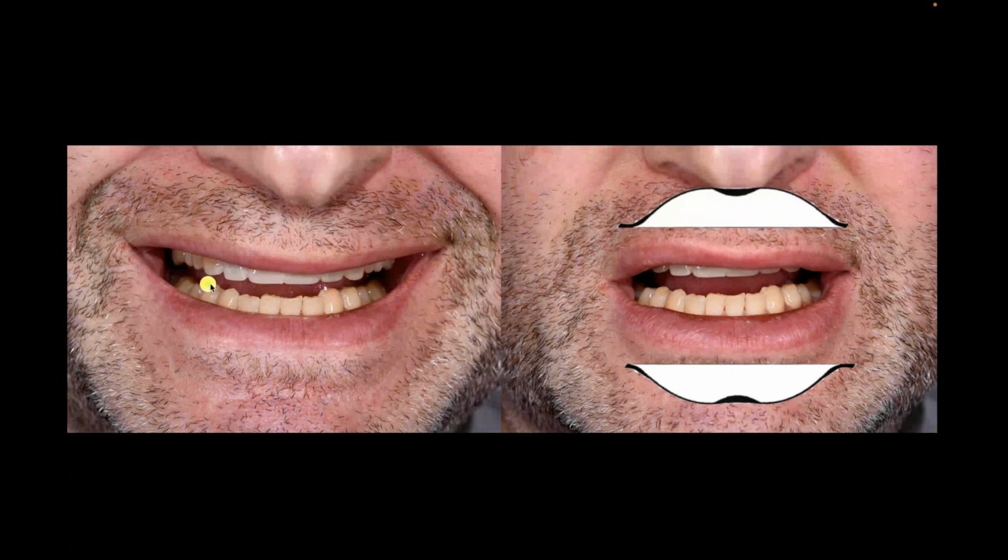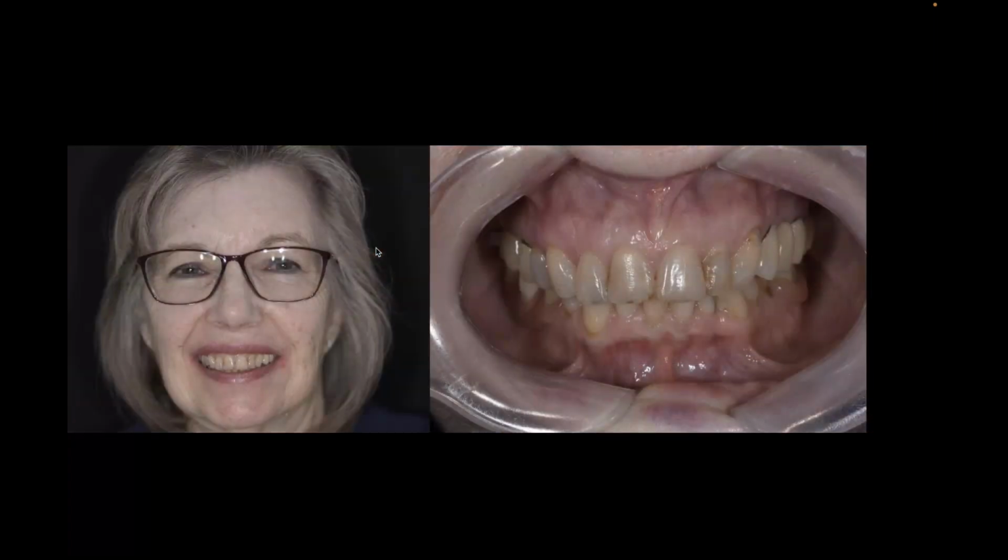It almost looks like my wax up is pulling up. Maybe it is a hair, but realistically it's because of the drop of the lip more on the patient's left side. So he's not going to get the incisal edge display that we'd like him to have. And because of that, he bought into the case. It will be a full mouth rehab, but at least it has set the parameters for us to know what the end result will be.